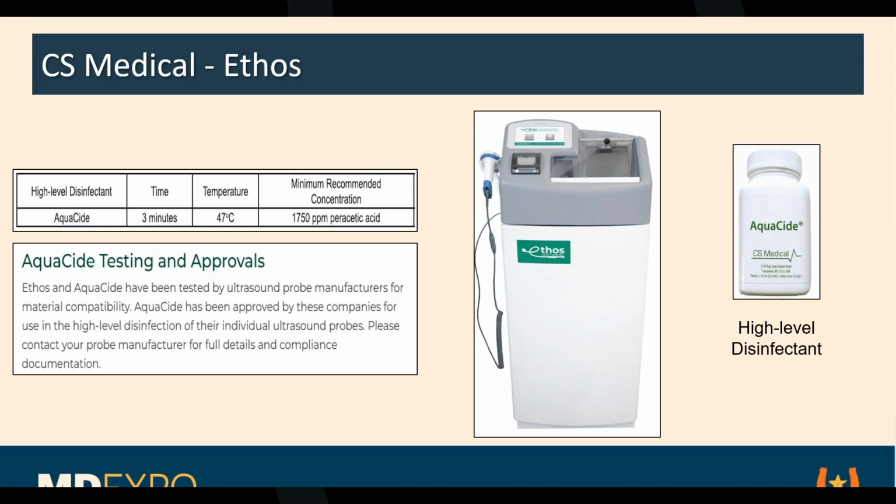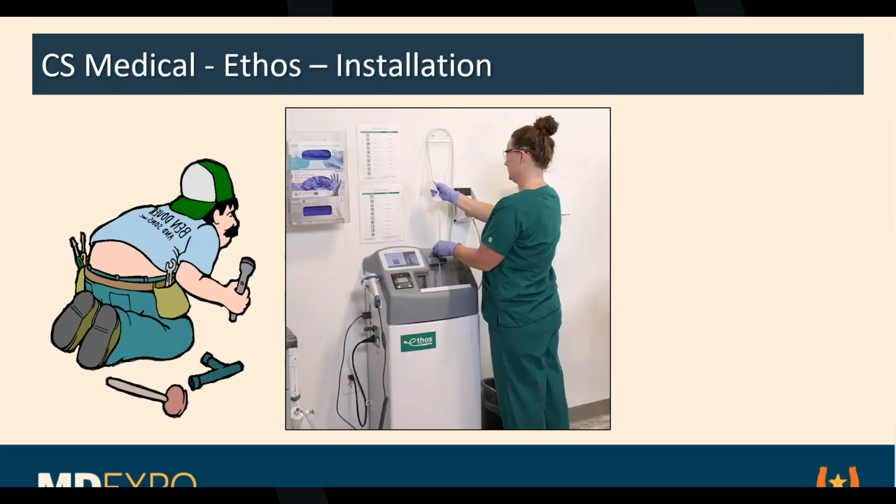But there is plumbing involved. I showed great restraint and taste by showing this photo rather than what I could have done with it. The reason for plumbing on Ethos is not only automated disinfectant, it's also automated cleaning. Without water, you can't clean. Right. Plus hand hygiene, soap and water.